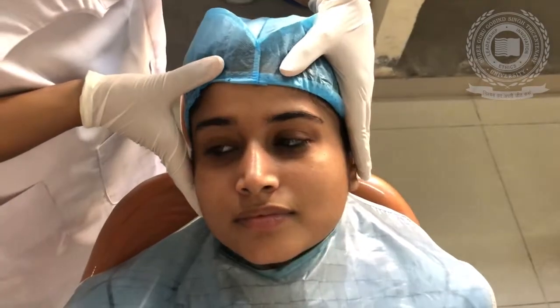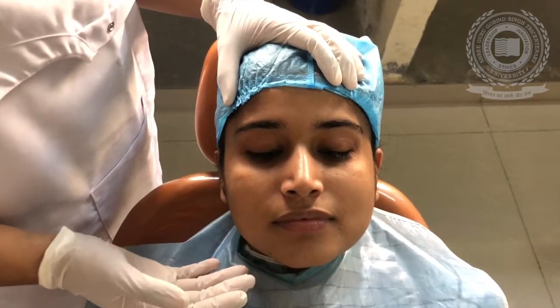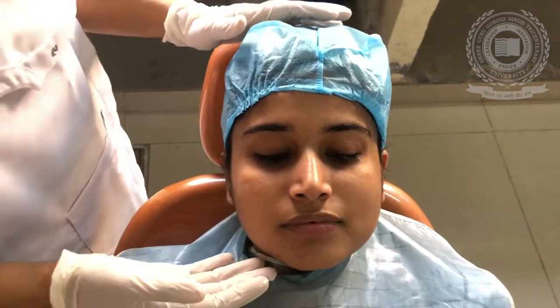Today I am going to demonstrate the fabrication of facial molage, which is very necessary for fabrication of any kind of maxillofacial prosthesis — maybe ear, nose, or any lost part of maxilla or mandible. Accurate facial molage fabrication is very necessary. So, let's see the steps of how a facial molage is fabricated.